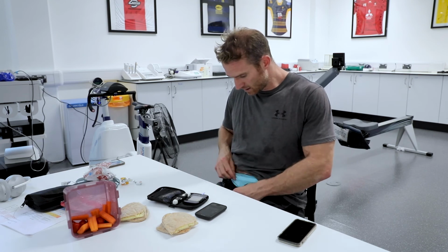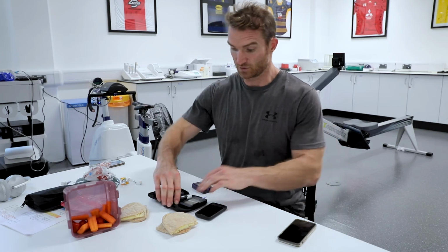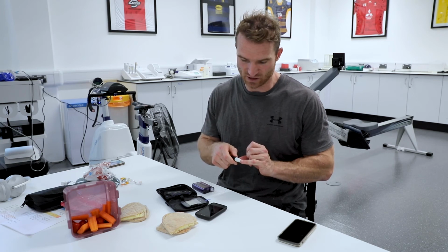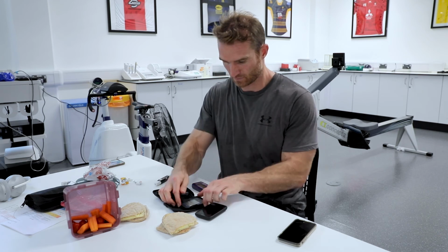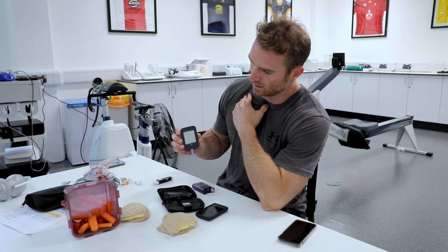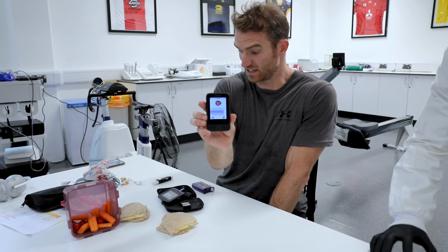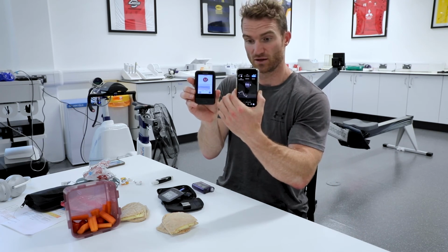So dialing in my 60, I'll first need to do my glucose test. As we said before, as we showed, the finger prick glucose was 7.1 after, and both continuous glucose monitors were a little bit behind. So it'll be interesting to see where that situation is now. We're about 5 or 10 minutes after. Okay, 6.6 on the finger prick. 5.4 now on the Dexcom, so that's caught up and it's trending, it's within 15%. And very similar, you've got about 6 on the Sapiens.